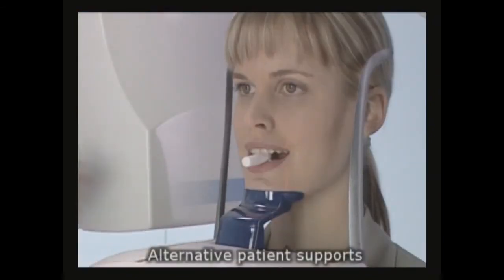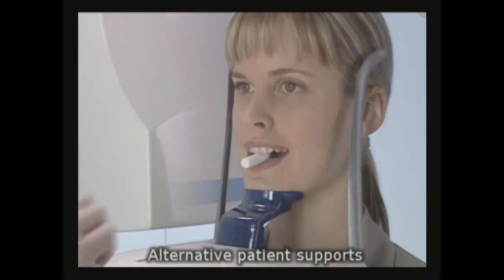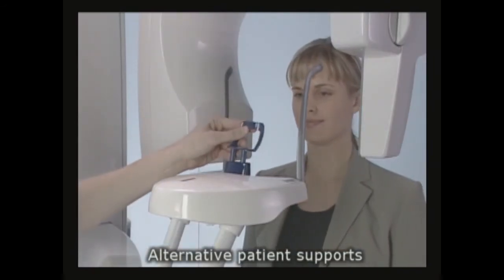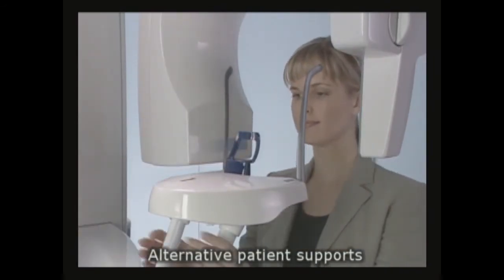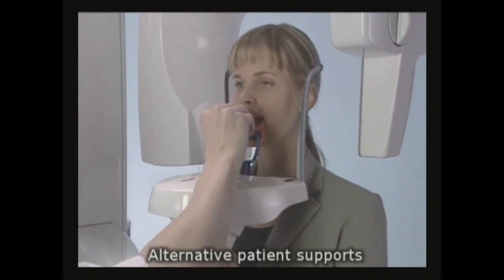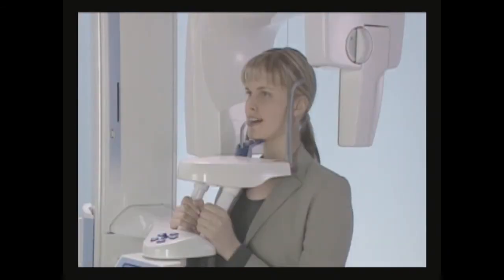If the patient cannot bite the bite piece, use the chin support or the chin cup for positioning. When using the chin support or chin cup, place a cotton roll between the patient's jaws. If you use the chin support, position the patient so that her chin, just below the lower lip, touches the top bar. Ask the patient to close her lips on the bite piece.